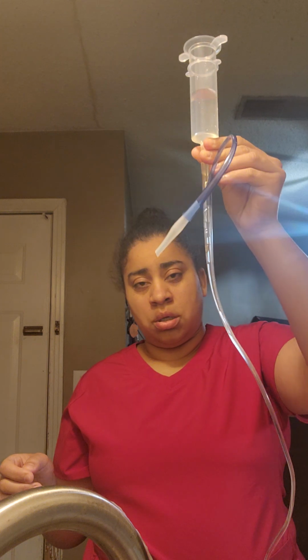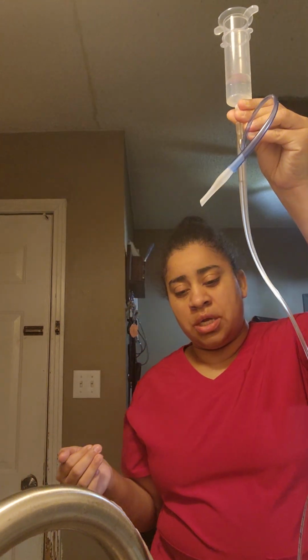I'm going to do 20 mLs, and I'm going to raise it up so my water can go down into my tube. The higher you go up, the faster it can go into the patient's stomach.